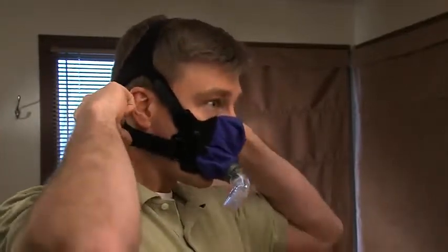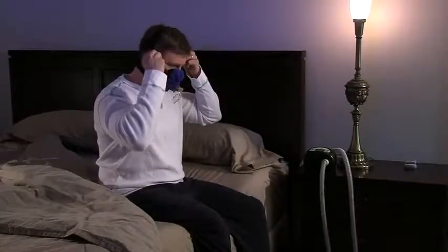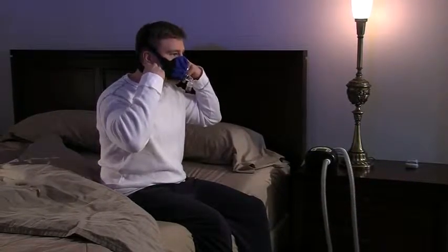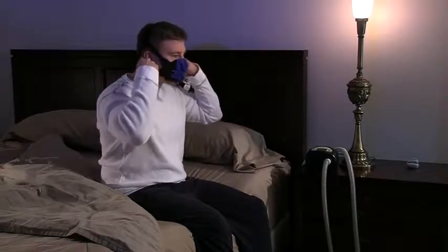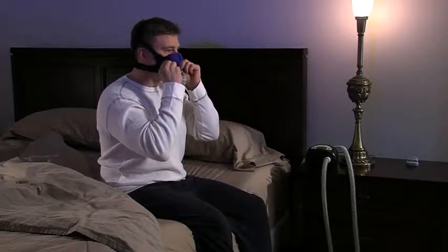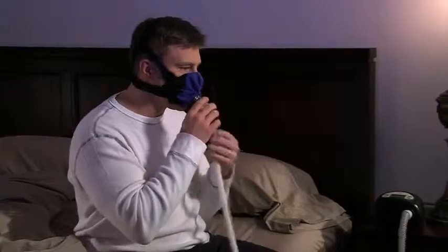Adjust the bottom straps so that the oral interface of the mask is comfortably in place. It is helpful to slightly stick your lips out when tightening the bottom straps to ensure that the fabric is going around the lips and not over them. Attach the mask end of your optional SleepWeaver featherweight tube, or connect your six-foot PAP tube directly to the 90-degree elbow.